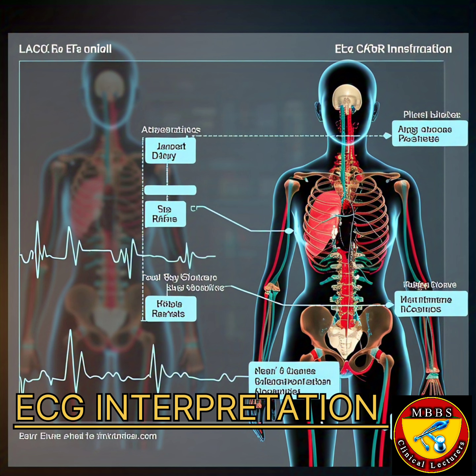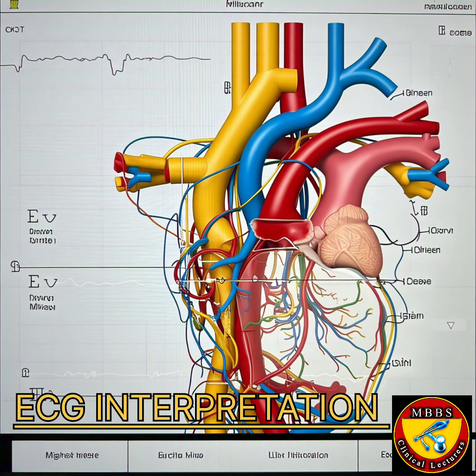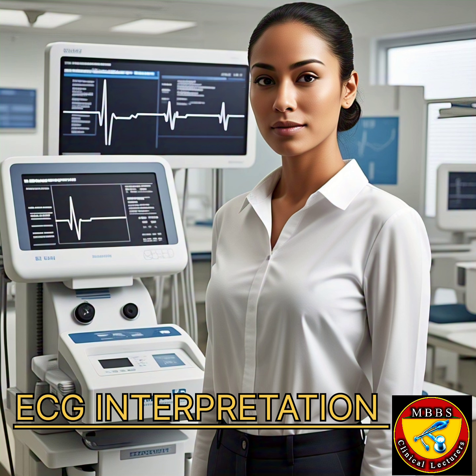Step 5. Consider the clinical context. Consider the patient's medical history, symptoms, and physical examination findings. Correlate the ECG findings with the clinical presentation.